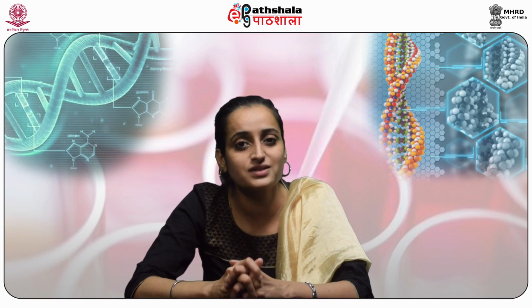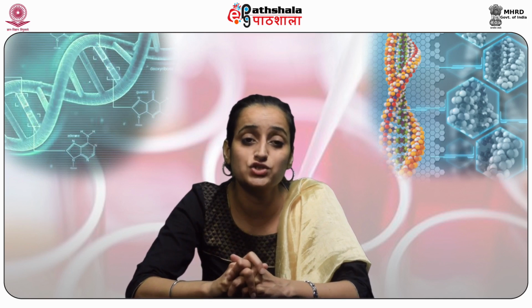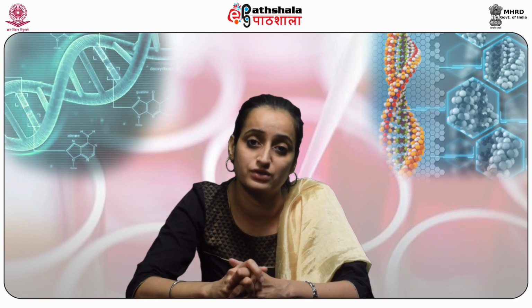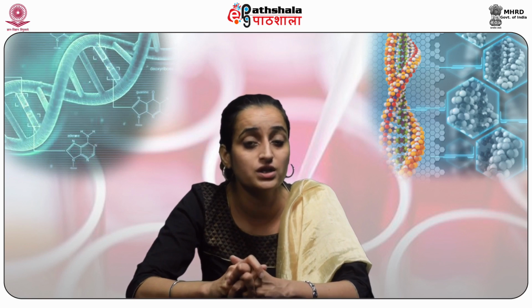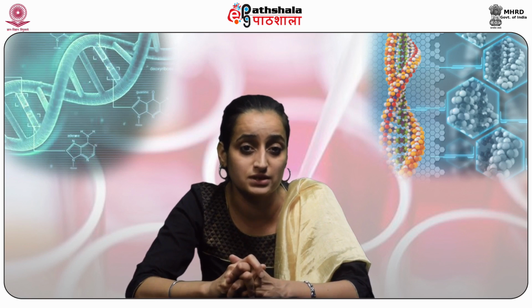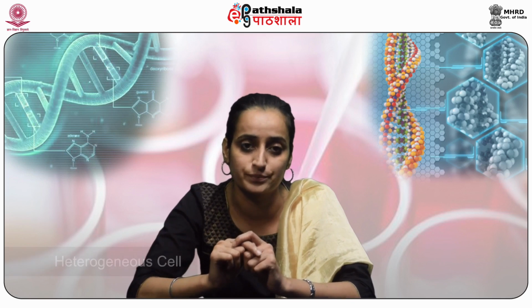So students, let us now summarize what we have learned in this module. ISH, or in-situ hybridization, is based on the complementary base pairing of labeled cDNA or RNA probe to normal or abnormal nucleic acid sequences in chromosomes, cells, or tissues. It is used mostly to detect and localize specific mRNA sequences within preserved tissues and cells that can be identified morphologically in a heterogeneous cell population.